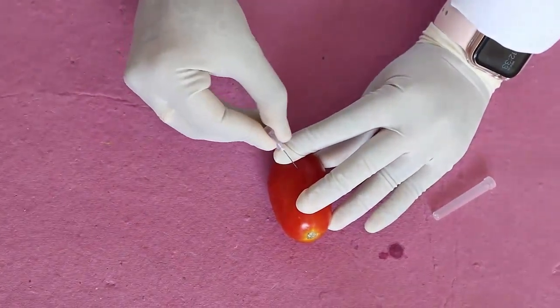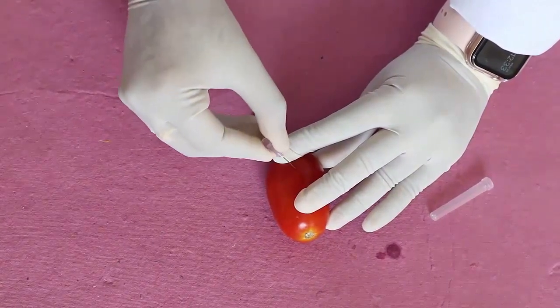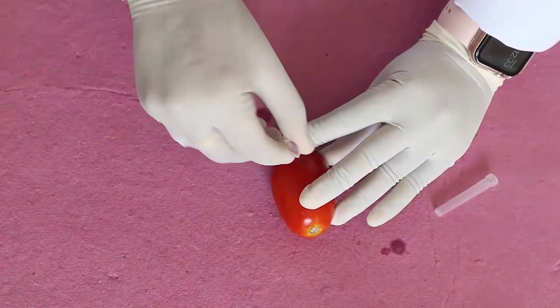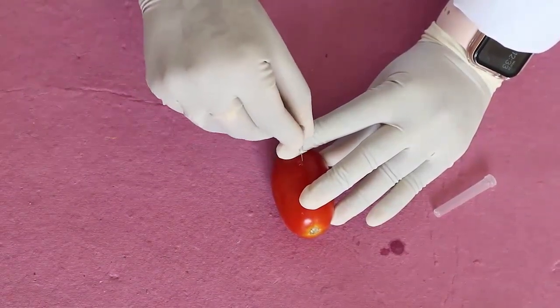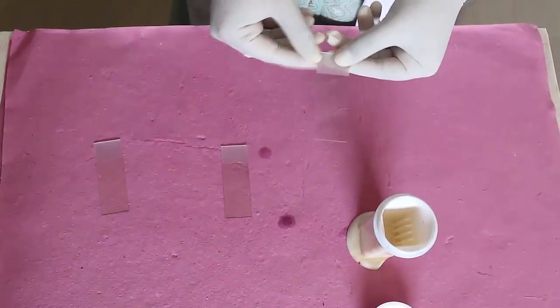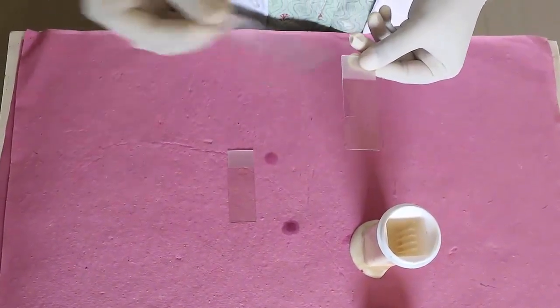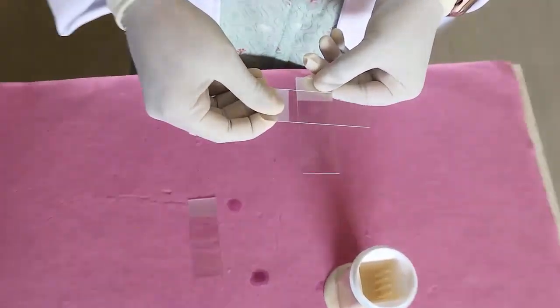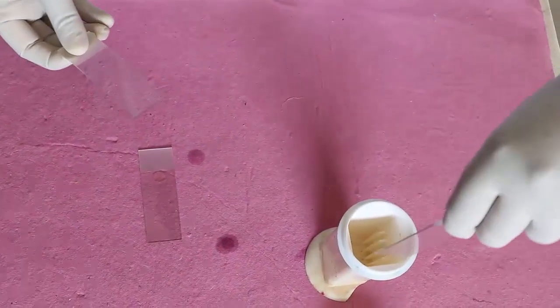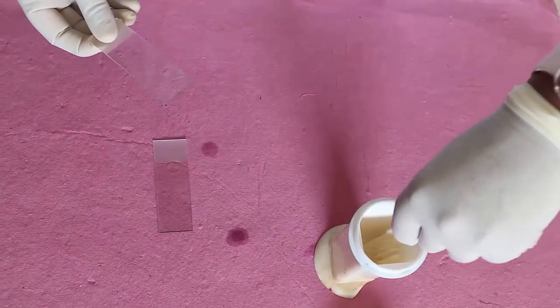Care is to be taken in order not to puncture the underlying trachea. The patient is asked not to swallow and not to talk during the procedure. Smearing. A second clean glass slide is taken, and with a gentle yet firm pressure, a quick, thin, single-celled smear is made, and the slide is then fixed in ethanol.